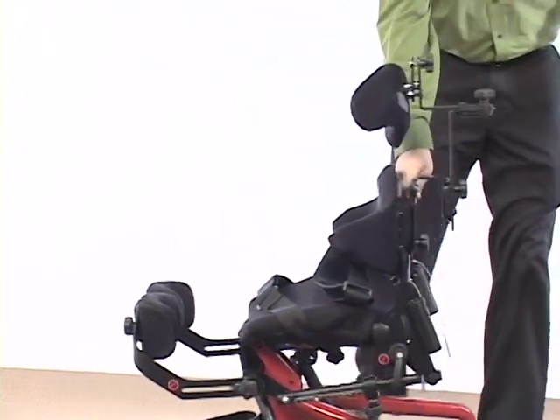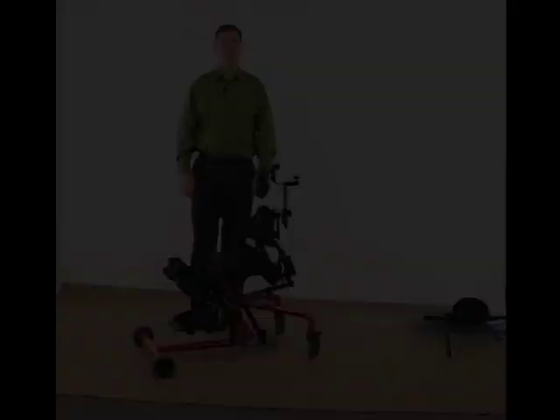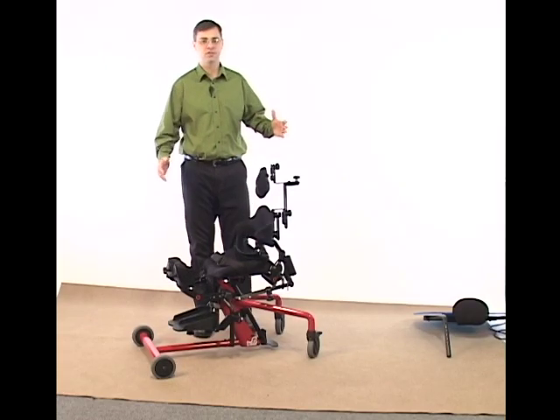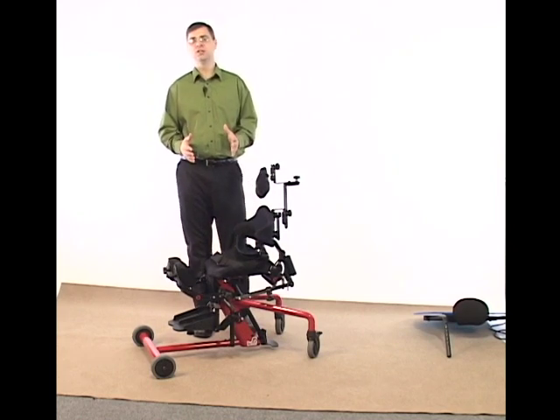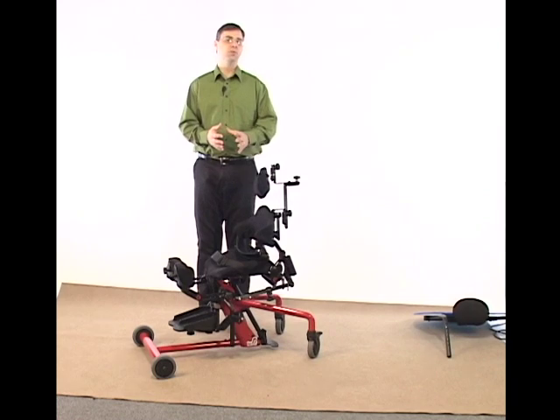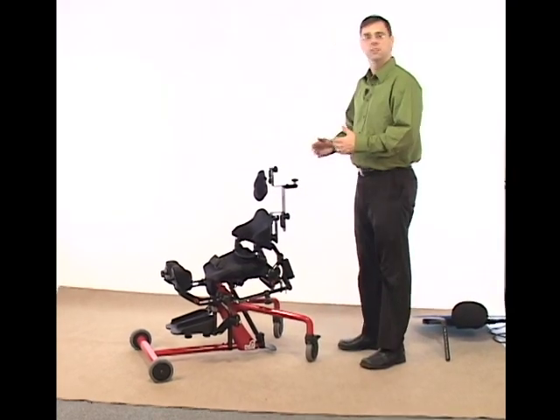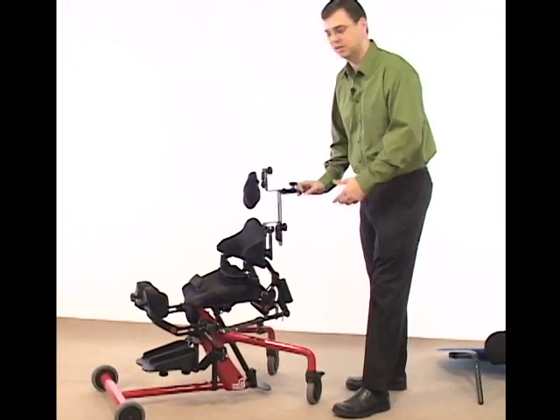Now that it's set, I bring it all the way down and check to make sure that my back angle is correct. You'll see when I bring it down to a seated position, I'm in a 90-degree seat to back angle. What we've just done is shrink down the seat depth three inches. Now we're going to take the same process and reverse it, putting the seat depth back to the longest or furthest seat depth position, doing the same steps in reverse and in the opposite sequence.